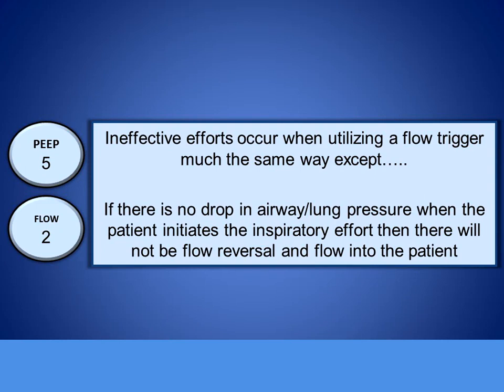I would say this, we can demonstrate this. Take a really big deep breath in, as big as you can, and then hold that breath. You are now a hyperinflated, air-trapping, asthmatic COPD patient. Don't exhale, but if you were to try to inhale from that point, you would find there is no change in pressure and no change in flow. So that's one way you can test that theory on yourself. Take a big deep breath, hold it, and then try to take another breath on top of that. What you'll find is that even if you're flow triggered, there's no change in flow there.